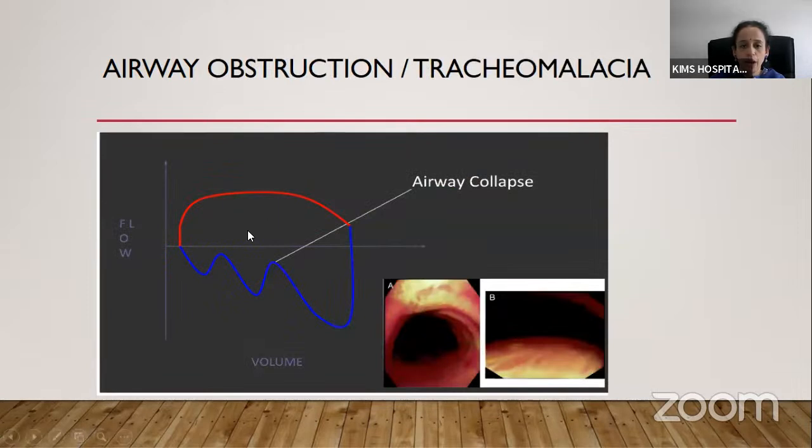If there is airway obstruction, you can see a similar kind of picture in the expiratory limb. So with this, we have completed the different scalars, loops and pulmonary graphics. Now we will go to the website and just see the different scalars and loops on the ventilator Excel.